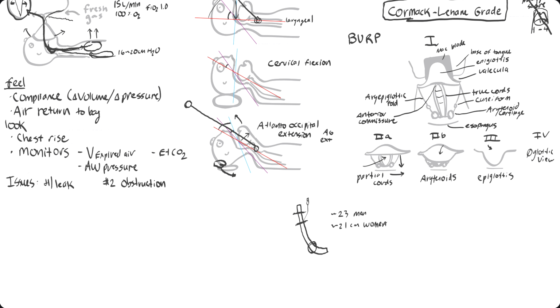Of course, different heights of people. Just be reasonable about the tube depth. And you will have to listen to the patient's chest to confirm that you have not inadvertently done a right mainstem intubation, so just for equal air entry on the left and the right hand side. And then you'll also get end tidal CO2 tracing to confirm. Now you're ready to tape the tube in place. And you're done. Now you just have to worry about getting anesthetic gas on board and starting your ventilator and doing everything else that we do.